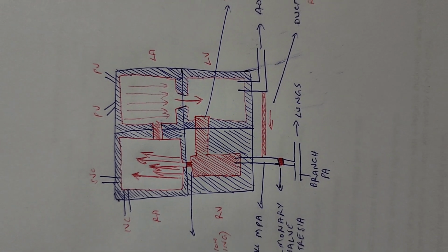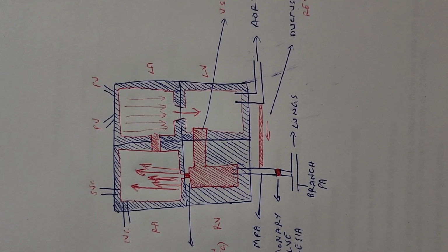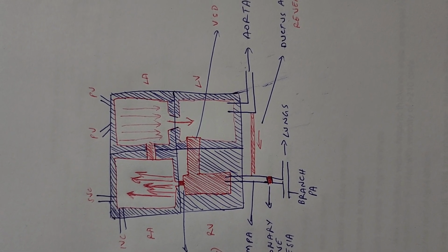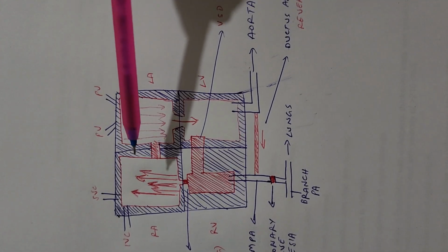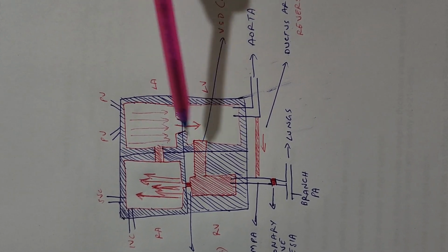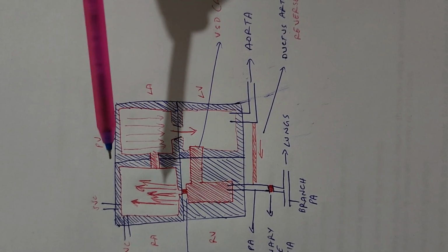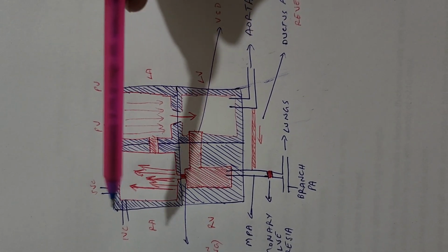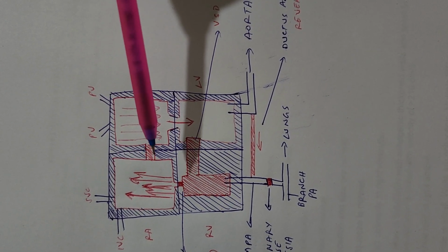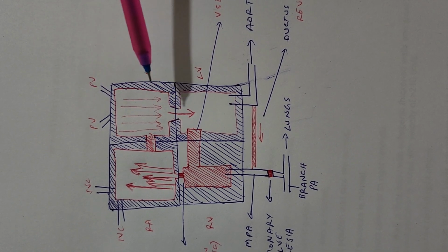So this is how we counsel the patient. Now we can see that this diagram shows the heart in a simple manner. This is right atrium, left atrium, right ventricle, left ventricle. Now in this patient, the SVC, IVC flow into right atrium. There is veno-atrial concordance. Foramen ovale appears normal. The pulmonary veins enter into left atrium.